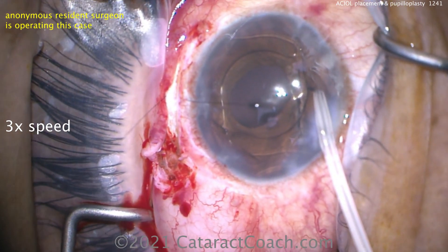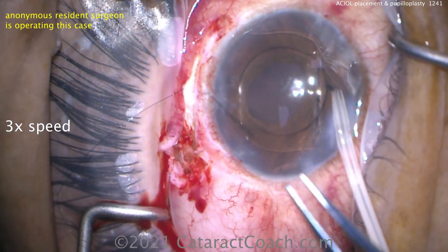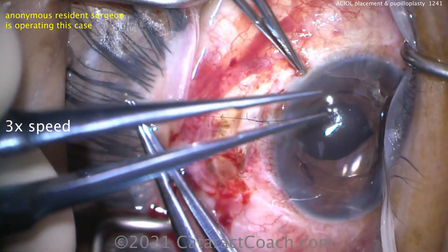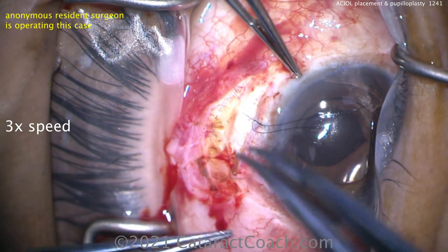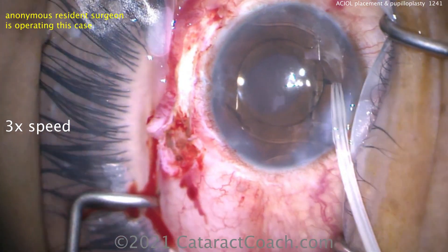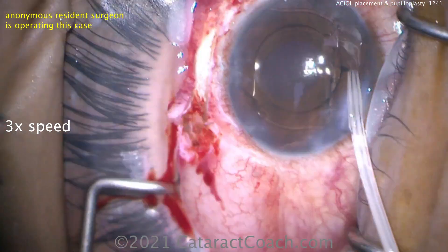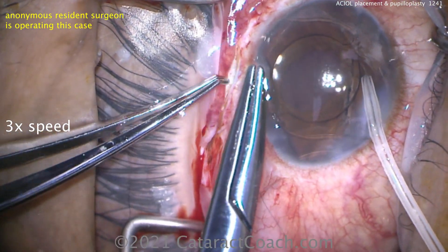We'll cut that off and the resident will suture this up — this is going to be a pretty good outcome. The patient was 20/40 on post-op day one, and was very happy. What do you aim for as a refractive target? This patient is around 35-40 years old, with the other eye totally phakic, healthy, and emmetropic. You can either aim for plano, or for just a little myopia — minus 0.5 to minus 1.0 is probably a good option. We'll let the resident redo the suture — let's fast-forward through that.